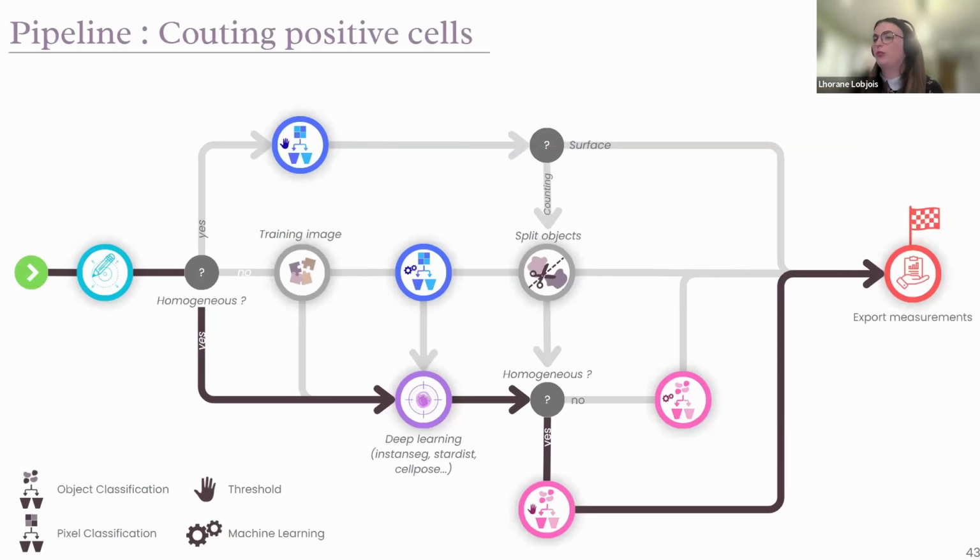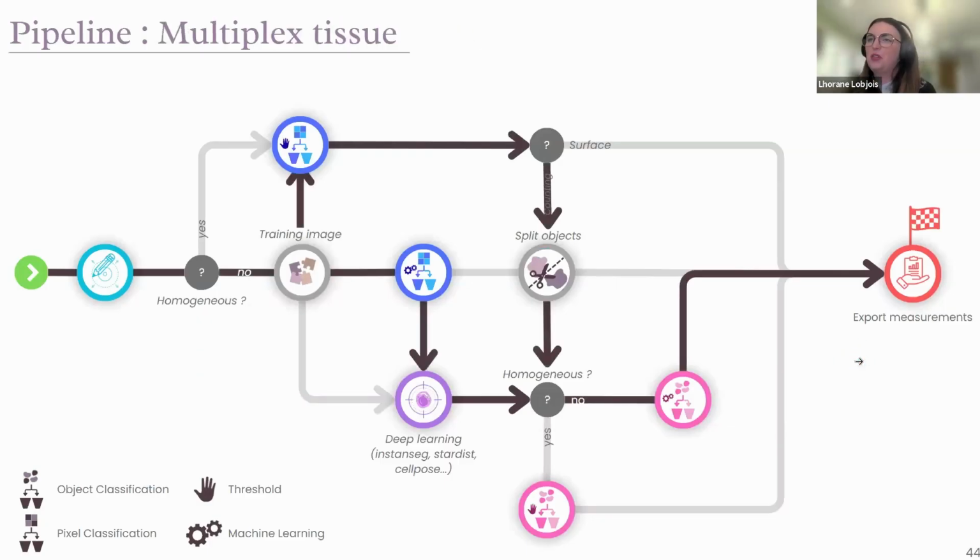So that's why I would like to present you a bigger one, which is the most I can use in my lab. This one is a different way to obtain your results. And it's a multiplex tissue.